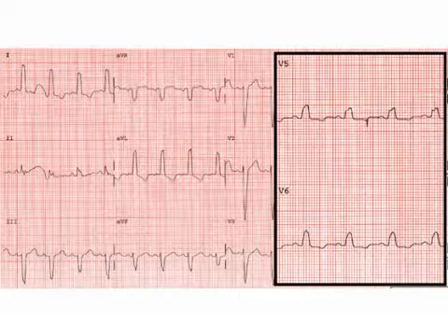The most important thing to remember about left bundle branch blocks is that you cannot diagnose any acute ischemic events because of the left bundle branch block pattern obscuring the parts of the ECG which are required. So in a patient like this, you have to rely on your story of chest pain and your cardiac troponins.